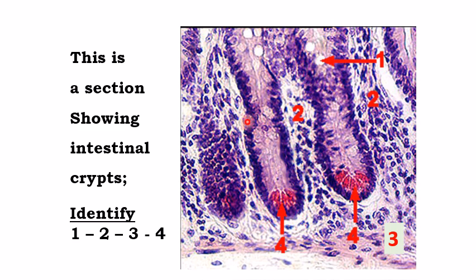Here, dear students, crypts. I'm having crypts only, and between them connective tissue. Is it small intestine or large intestine? It's a small intestine. Why? Because I can see the Paneth cell with basal basophilia and apical acidophilia, and the goblet cells are fewer than those present in the colon. 1 goblet cell, 2 connective tissue corium, 3 muscularis mucosa, 4 the Paneth cell. So it is small intestine.